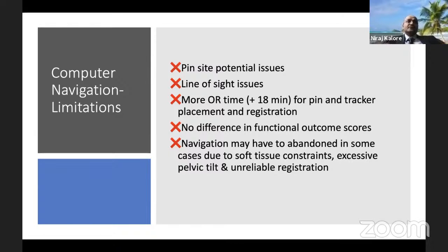What that is: between the reflecting spheres and the camera, as well as between the reflecting spheres and the source of the infrared light, you can't have any obstruction. So if you have obstruction, that's going to cause error. And we are looking at directly in the surgical field, so you have to constantly move around, make sure you are not getting in the field of the camera, and that's a headache.